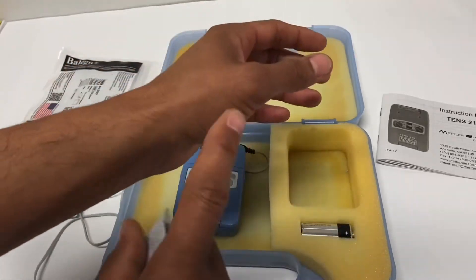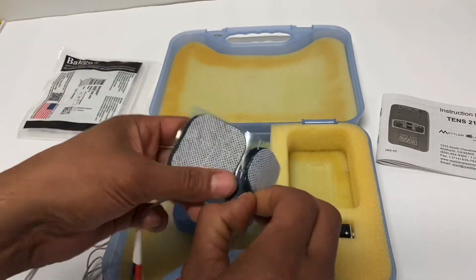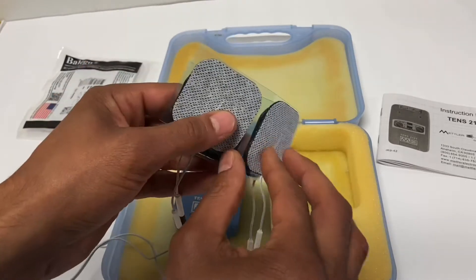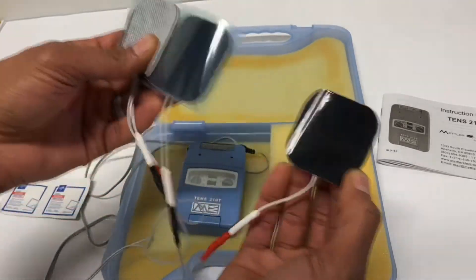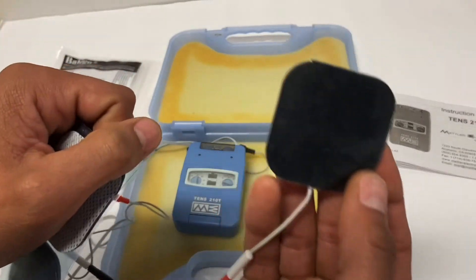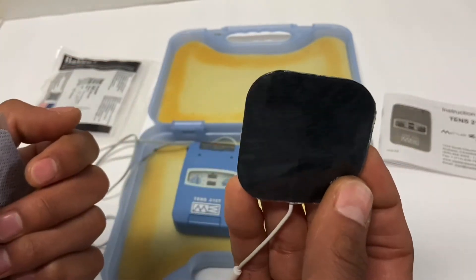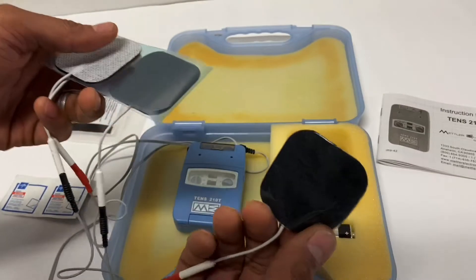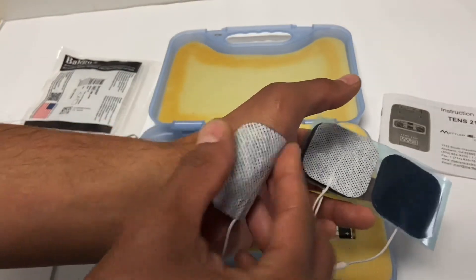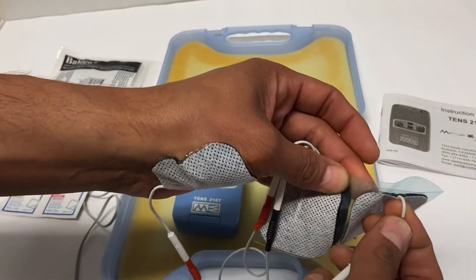For actual placement, let's use my thumb as an example. When you pull the pads off, do not pull from the wire — pull from the side so you don't compromise the connector. The connector is strongest in the middle. When looking at pads, if there's a big hole in the glue where the black rubber underneath is exposed, that pad is no longer good — toss it and get a new one, as it can irritate or even burn the skin. We'll place this here — I didn't prep my skin, just for demonstration purposes.